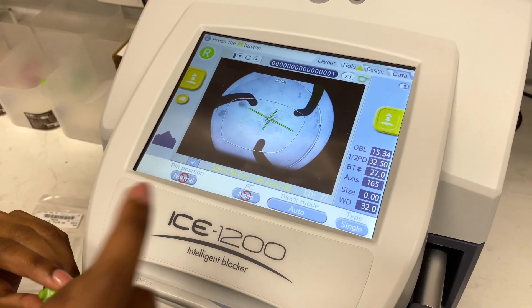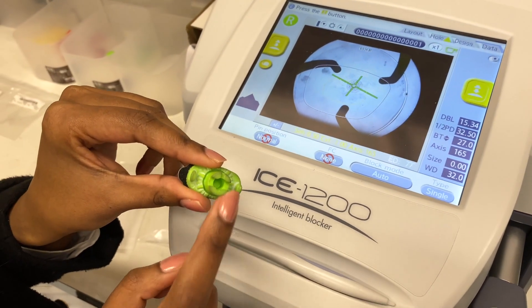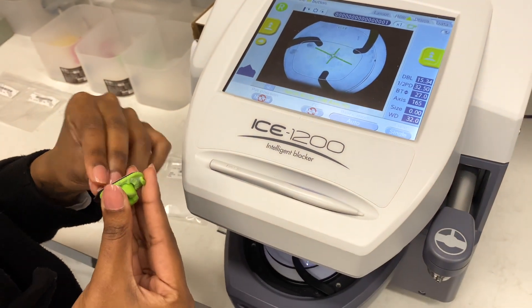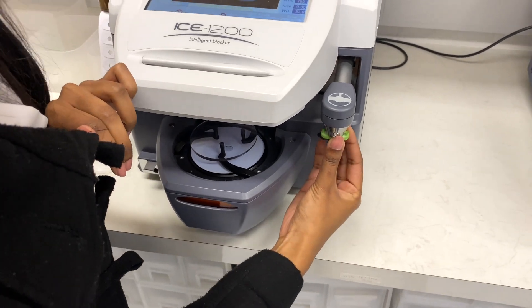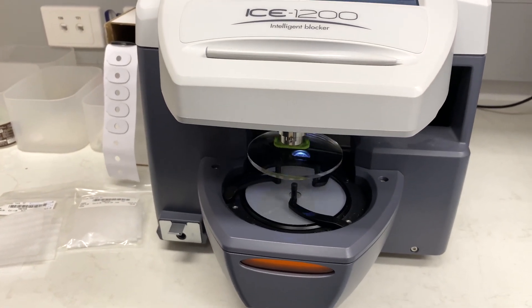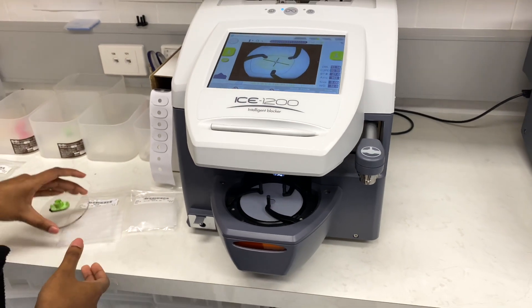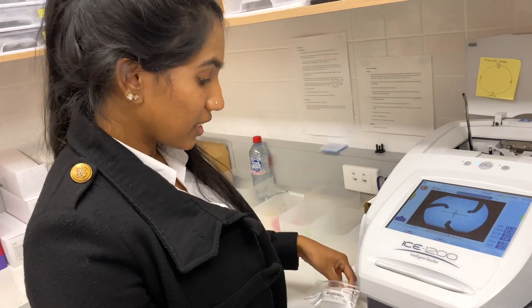After placing the lens in the right orientation, Sammy takes a piece called a block, which holds the lens in position during cutting. She inserts it in the machine and presses the yellow button, which blocks the lens automatically. Once the right lens is done, she repeats the same steps for the left lens.